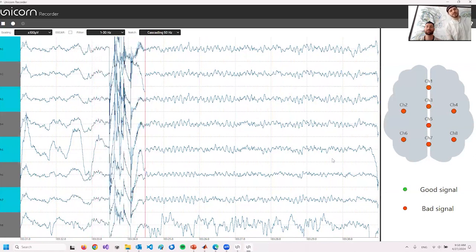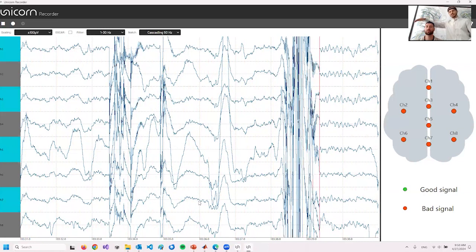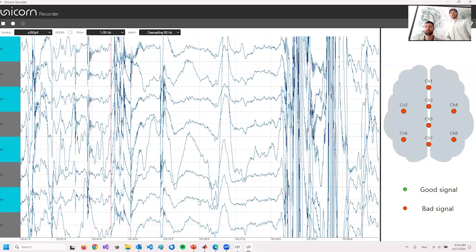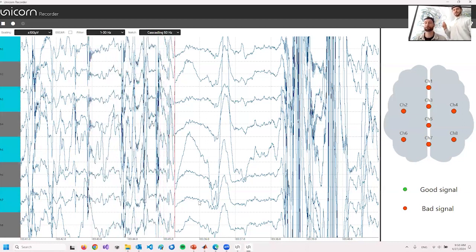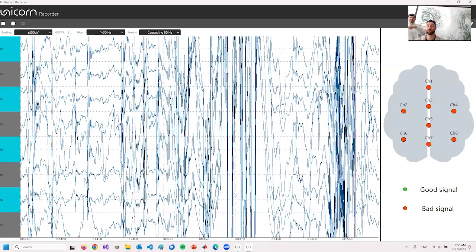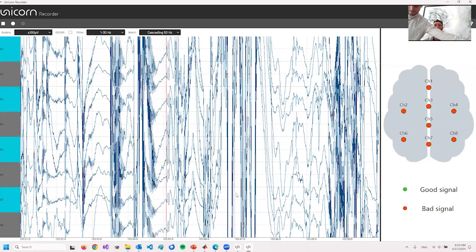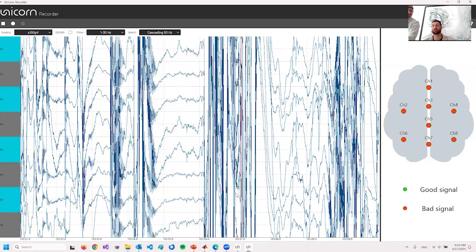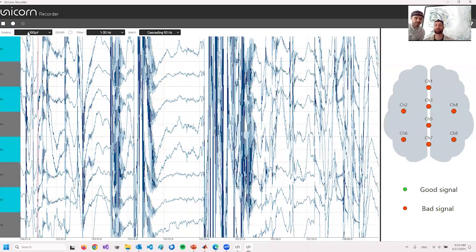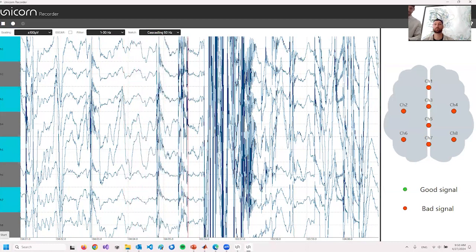And right now we recorded dry EEG. And you can see I can easily disturb this. So that's why you usually use dry EEG when you're alone and not moving much, because otherwise the EEG looks messed up pretty quickly. And I'm going to add some gel right now because I'll be moving around Leo a bit. And we can see the EEG in parallel.